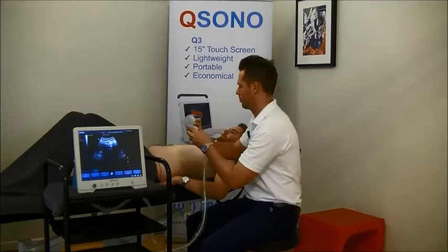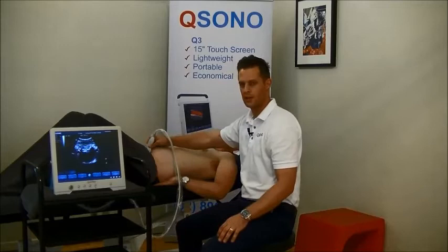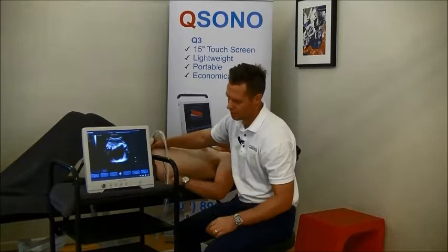So we've got a towel just above the pubic bones here, just so the patient's nice and comfortable. And we're just going to angle the probe back and down until the bladder comes into view. Now normally if we're doing this, we're going to be doing it for biofeedback so the patient can see. So we might have the ultrasound unit facing myself and also facing the patient so that they can see everything that's happening. But just for the purposes of this, let's focus it out here.